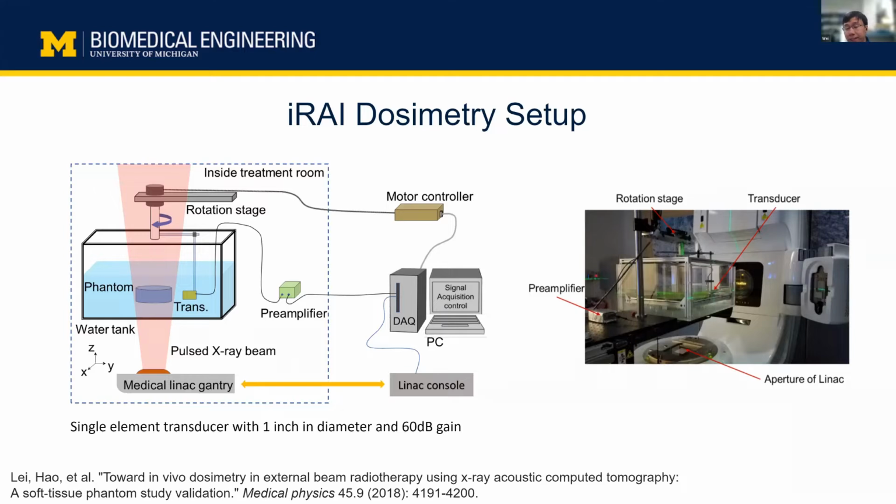Also, this setup is mostly focused on phantom studies. And you can see that our preamplifier is shielded really well, just in case we induce any noise from the radiation source.